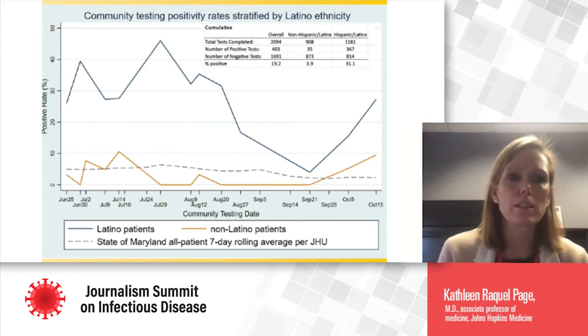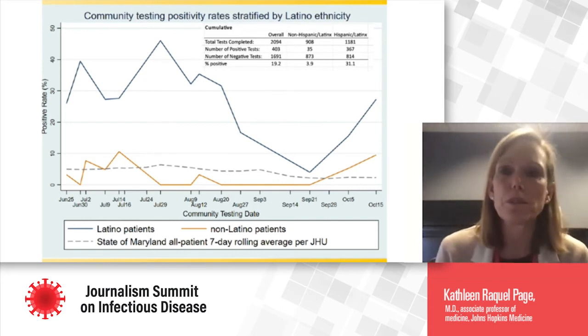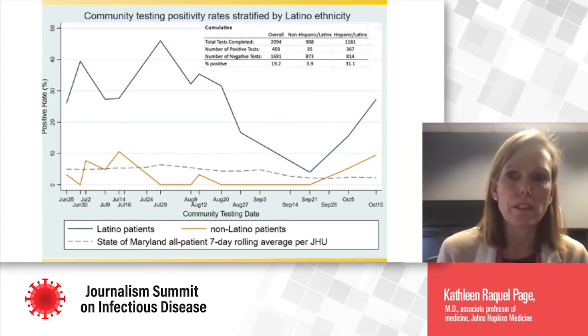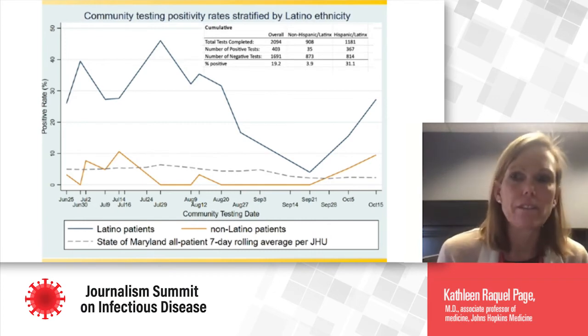Heba mentioned a little bit the issues with sensitivity. So we are doing nasopharyngeal swabs. We have worked with Heba to try to validate other tests, but right now we're using nasopharyngeal swabs for the testing. And Heba mentioned the high sensitivity of these tests.